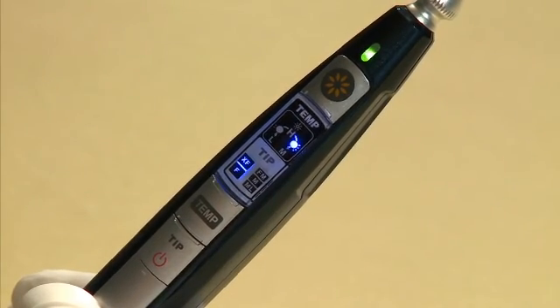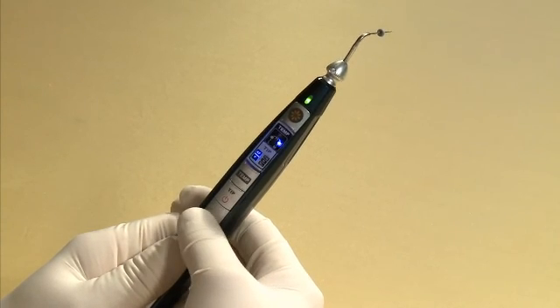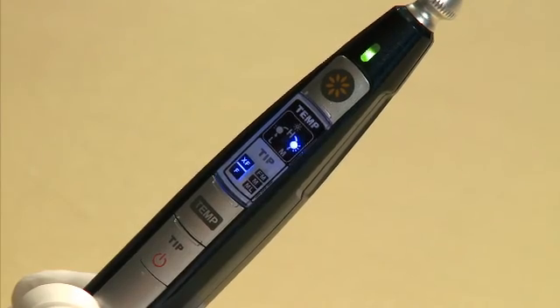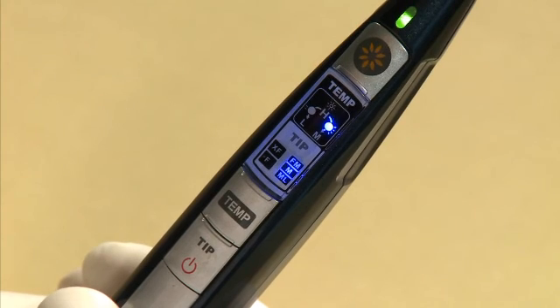The default setting for tip size is XF/F, which is indicated by the XF/F indicator on the handpiece. Press the tip button to change the tip setting. Pressing once will change the tip size to the FM/M/ML indicators.